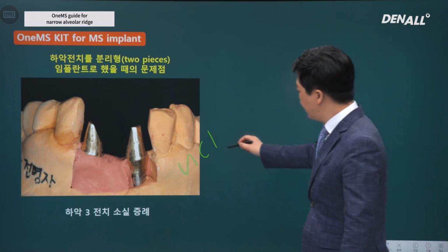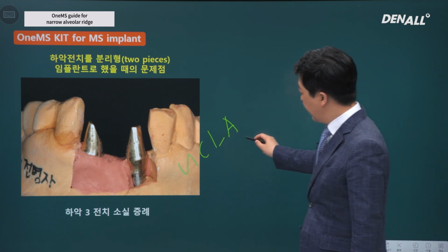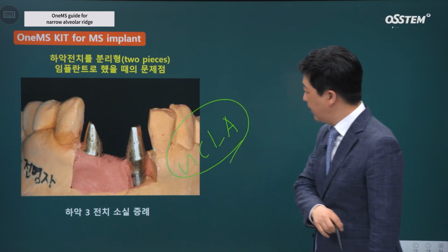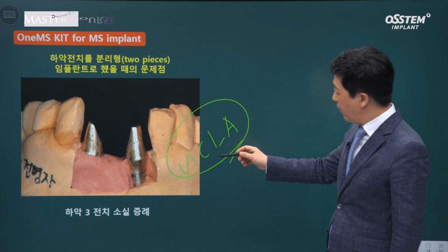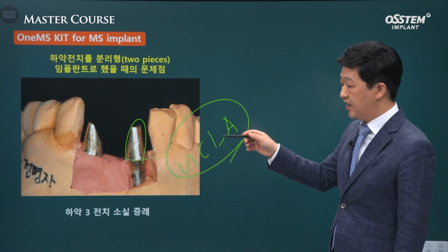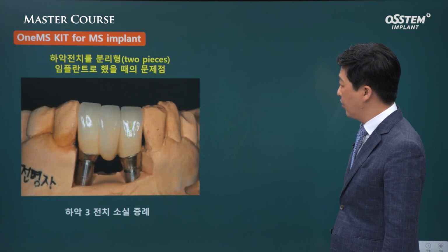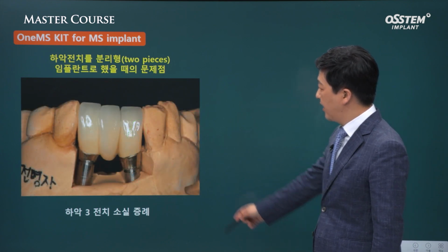Interns who have earned their license these days may not have heard of UCLA abutment. This was frequently used about 20 years ago. This is a gold casted abutment. This is before custom abutments became available. Gold abutment was fabricated and final prosthesis was completed like this.